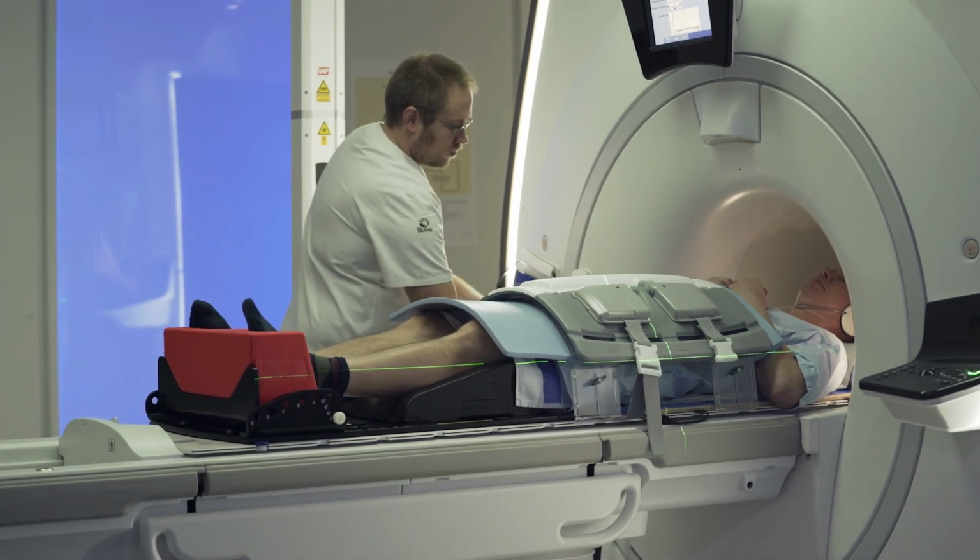MRI-only treatment planning will change the way we do radiotherapy. With MRI, we are able to see the details of what we irradiate. Up until now, CT has been the primary imaging modality for radiotherapy treatment planning. CT is great for those calculations, but not as great for visualization of the volume that needs to be treated.